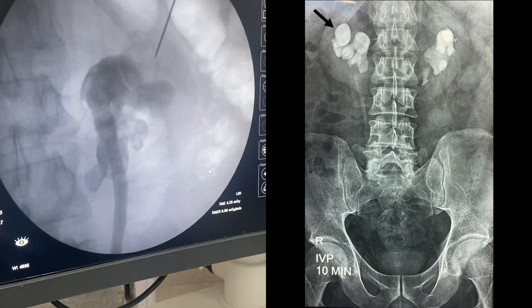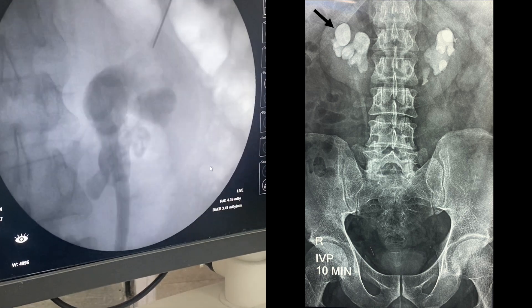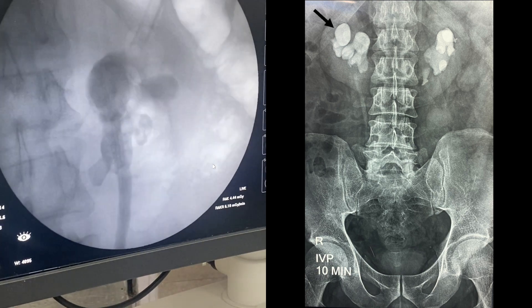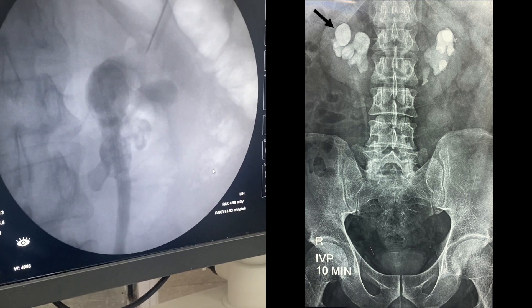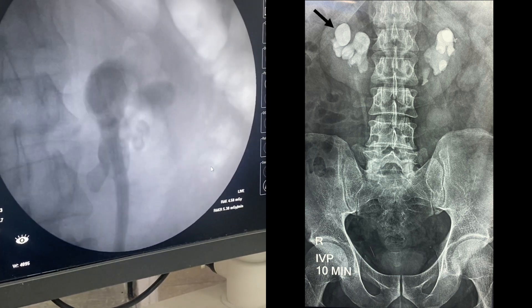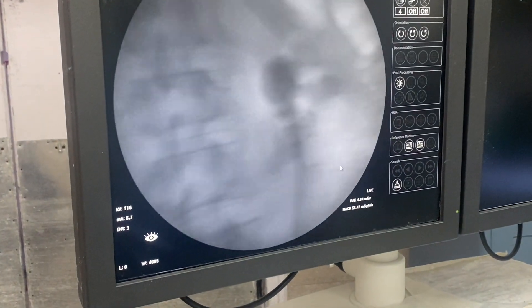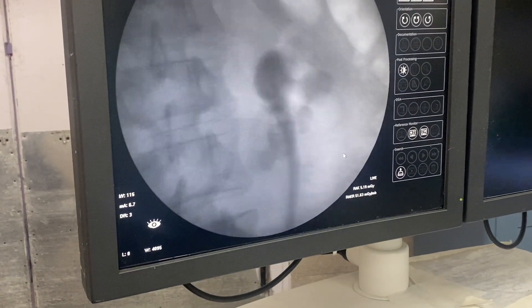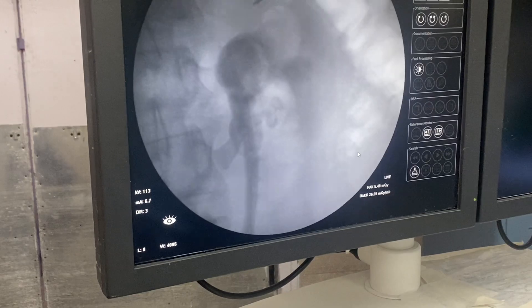For identifying the superior calyx — pointed out in the IVP with an arrow — an air pyelogram was done. You can see a faint calyx being opacified in the region of the superior calyx, the same as identified in the IVP. To identify its orientation, the C-arm (SIAM) is turned from 0 to 30 degrees and you can clearly see in the fluoroscopic image that the calyx is moving medially.